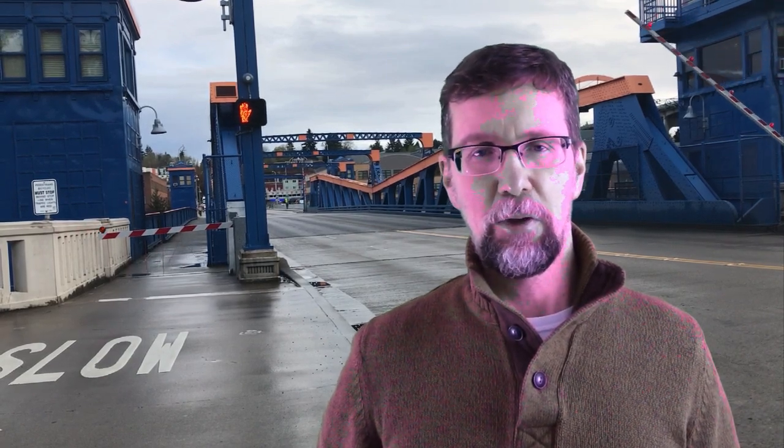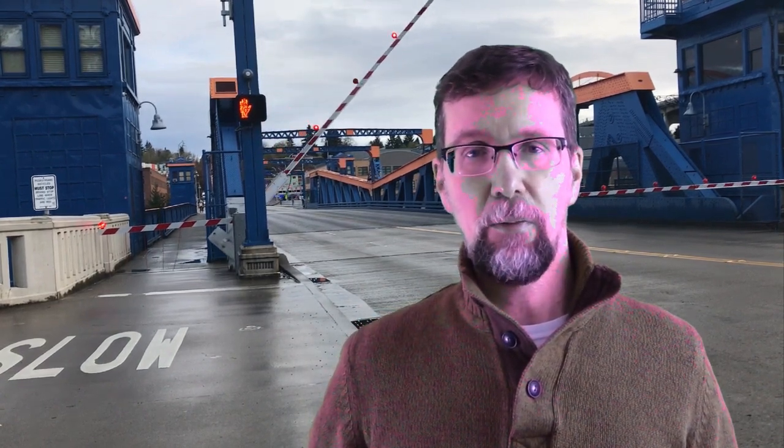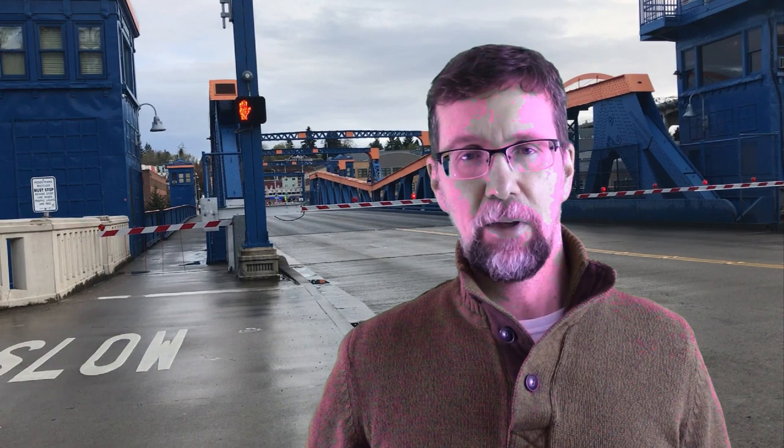Welcome back. The topic of this video is motion management. This is a very important topic in radiation oncology because, as you recall from the previous videos, we can control very precisely where a radiation beam goes in space, but we need to control also where the patient is in the anatomy of that patient under that beam in order to achieve what we want to achieve. So there are many various aspects of this.